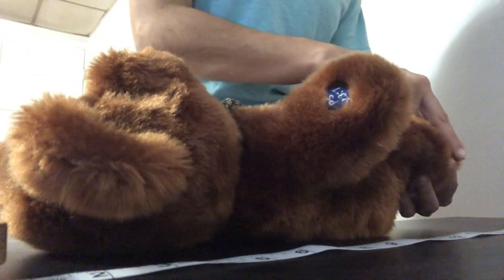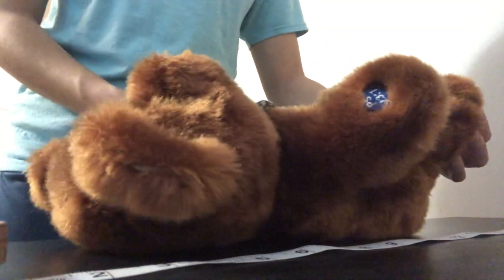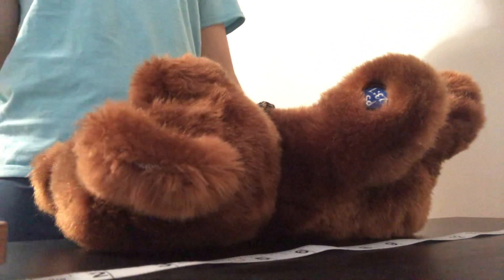So right now here, it is 15 inches. After that, I am going to go wash my hands, and then I'm going to document the measurements on the paper.